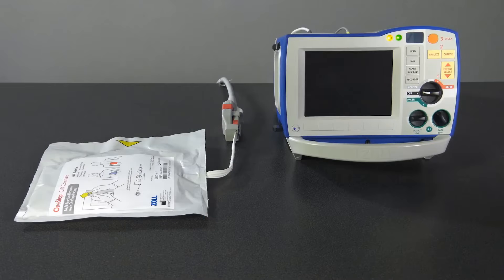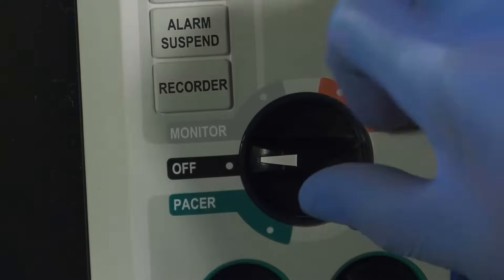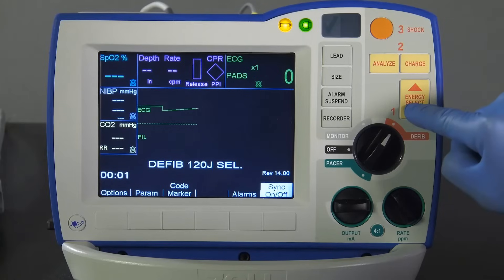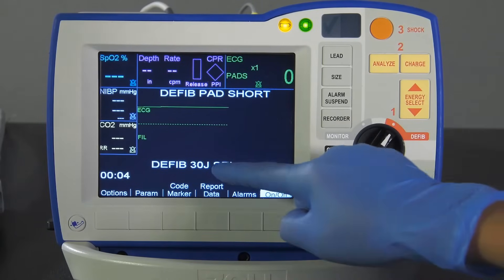To perform a manual test, ensure the one-step cable is plugged into either one-step electrodes, paddles, or the test port. Turn the mode selector to defib. Set the energy to 30 joules and press Charge.